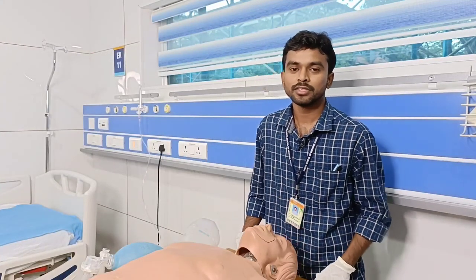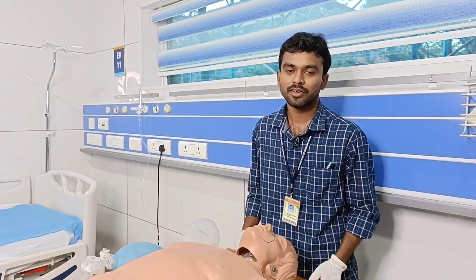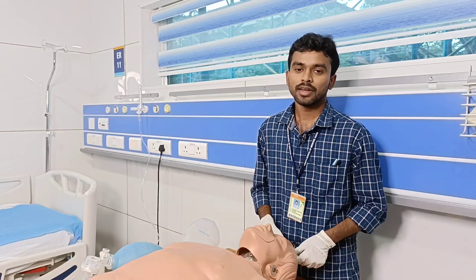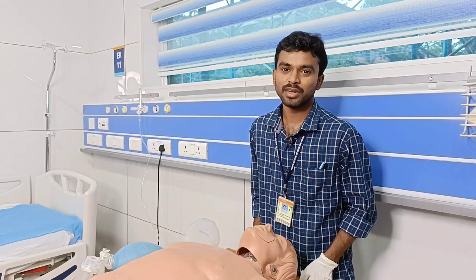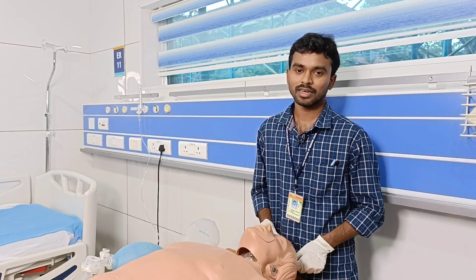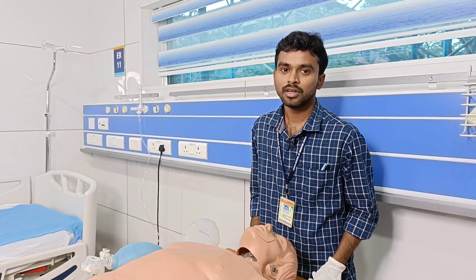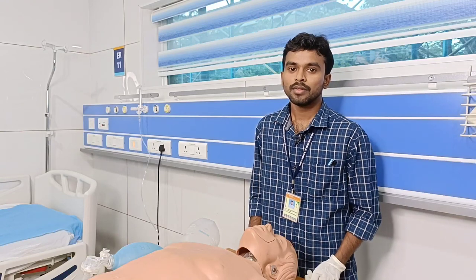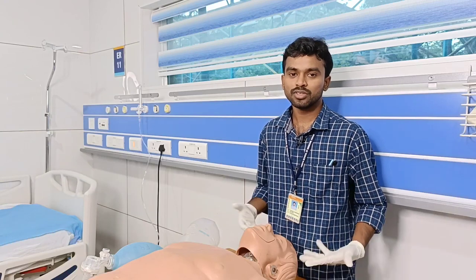For the procedure of bag mask ventilation, we first assess the patient's airway. If the patient is talking in a normal voice, there is no immediate airway compromise. We check for airway sounds — any stridor, gurgling, or snoring. If the patient needs bag mask ventilation and is hypoxemic, we open the airway using airway maneuvers.